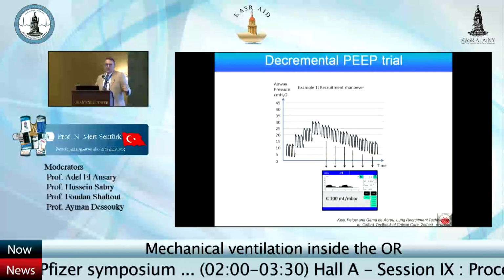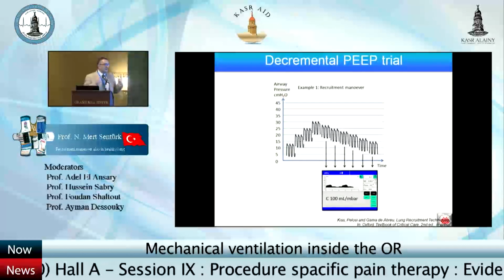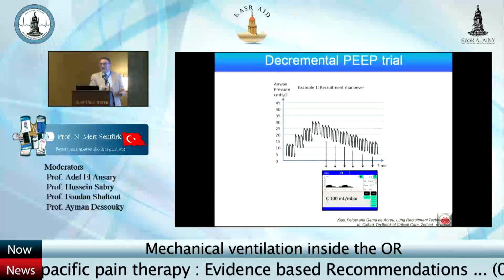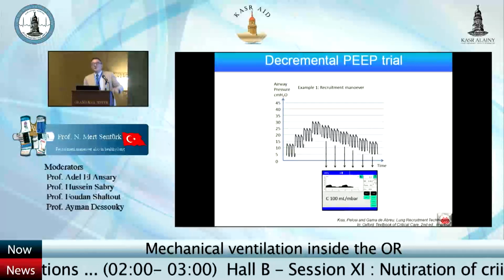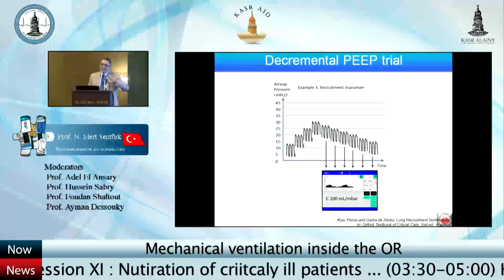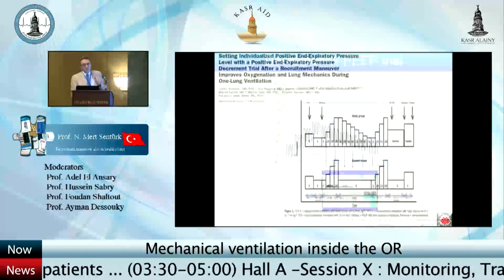Theoretically, it sounds very good. Practically, during the OR, I know it is almost impossible for all of us to do all these things. And afterward, think about it: you see some secretion there. You want to aspirate the secretion, and you have to repeat all these sequences again. It's quite impractical. But now we have some solutions.